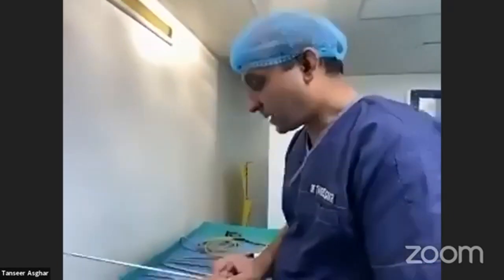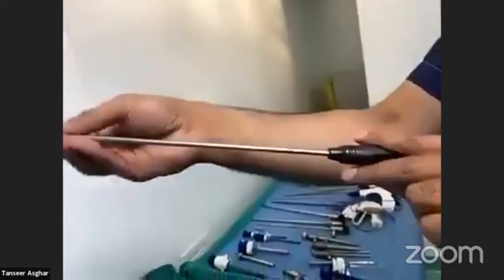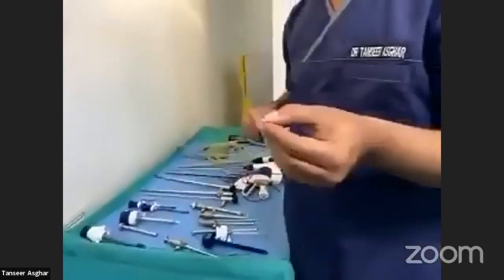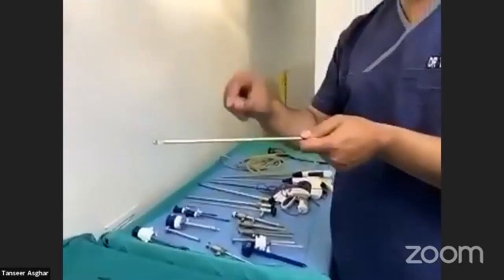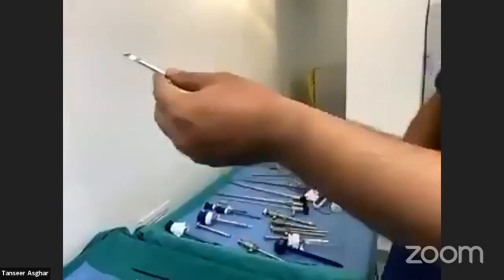This is a very important instrument called the knot pusher. You can see there is a hole inside it. It is used for extracorporeal knots — for example, when tying the base of the appendix, you tie the knot outside and pass it through the knot pusher. When you push it in, the knot slides into position inside the abdomen.